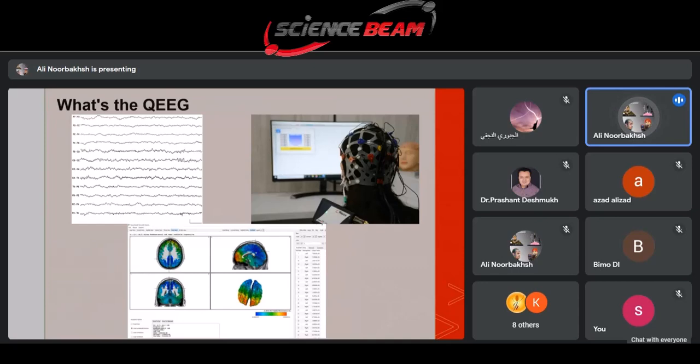First, we should record the EEG signal. You know that for QEEG, for neurofeedback, first we should record the EEG signal. We should put an EEG cap on your client's head, and then the EEG cap, which contains electrodes, just reads brain activity.